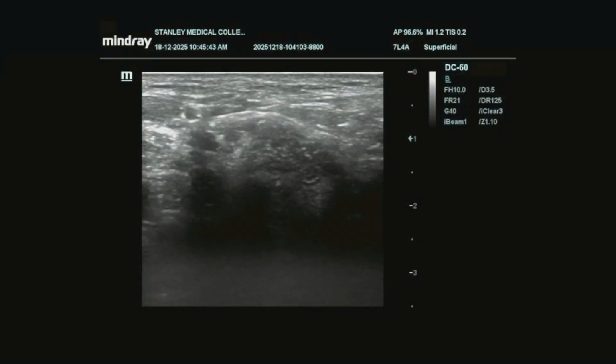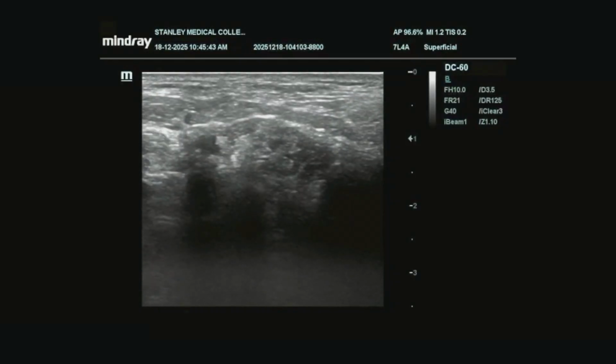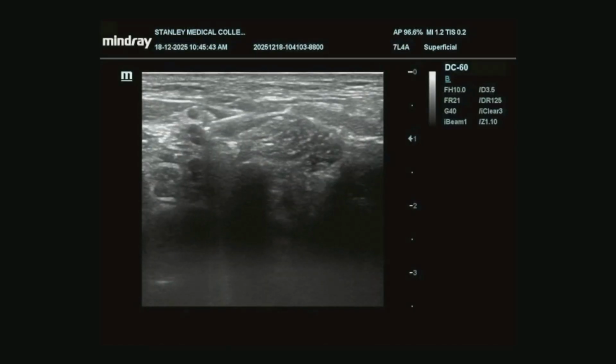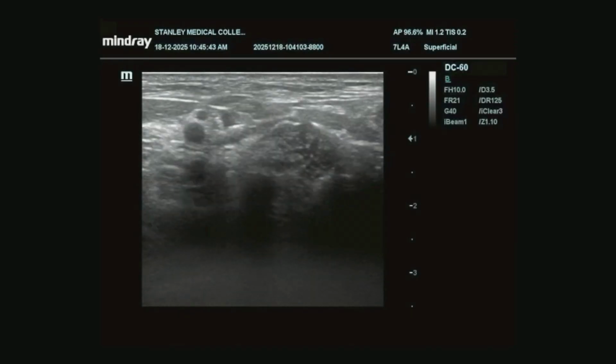When you target the nerve, you might accidentally injure the nerve. So as I advance, I could see a distant pop. As I inject local anesthetic, it's spreading somewhat laterally. So I'm not happy with this, so I make small needle adjustments.